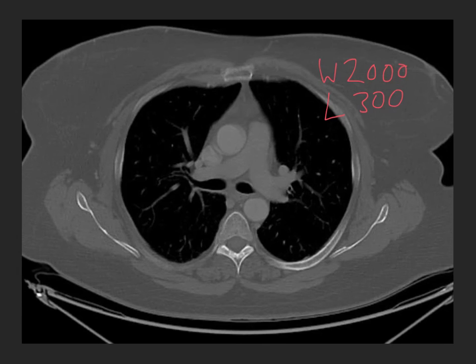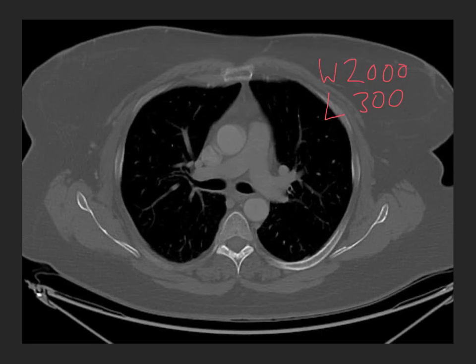To reiterate why we do this: we want to concentrate those 256 shades of grey into the range of expected densities within the tissues we're interested in, because our eye can only detect a 6% difference in grayscale.